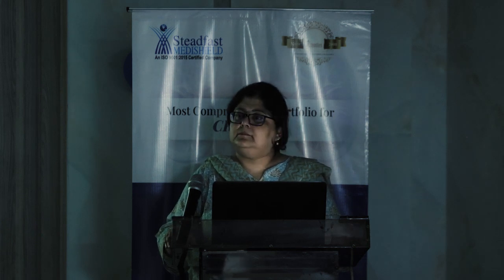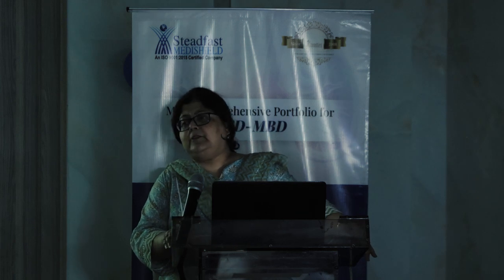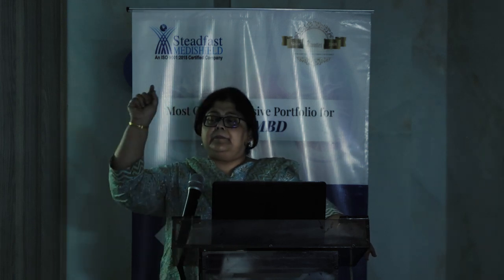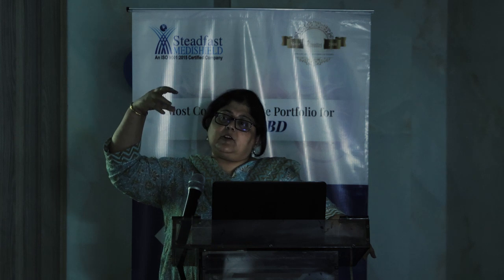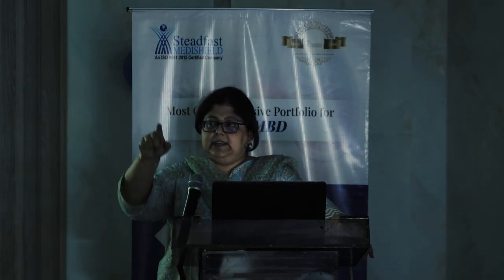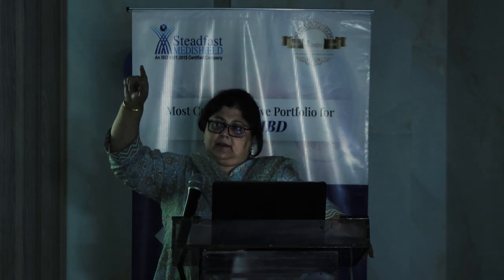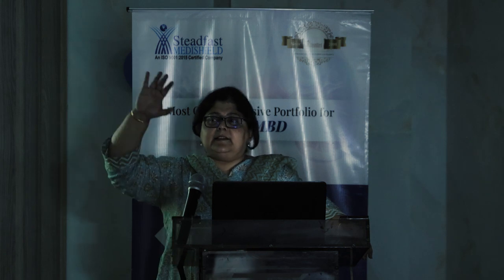Sure. Can we differentiate pyelonephritis and scarring based on DMSA? Pyelonephritis and scarring. In an acute pyelonephritis, you will not get a volume loss, so there would not be a cortical volume loss. You will see the contour of the kidney, but there would be an area where there will be less uptake. So that's an acute pyelonephritis.